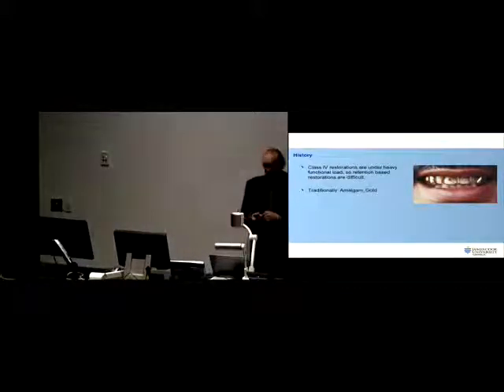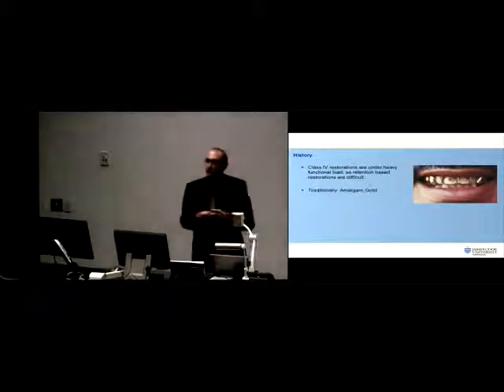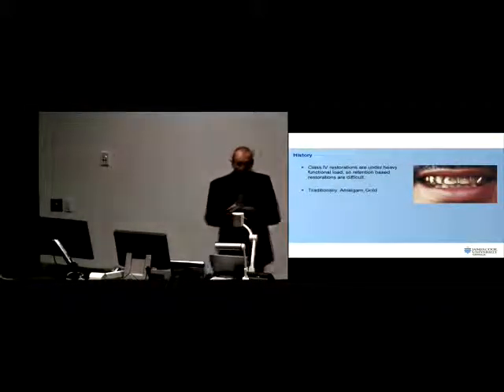Looking at the history, class 4 restorations are a little bit difficult because they are under heavy functional load. So usually retention-based filling procedures are difficult. In old times, we did inlays, especially in class 4, we did pinlays, and this was really difficult work.